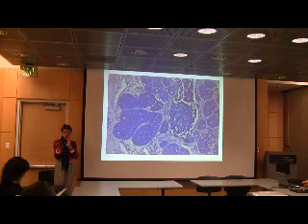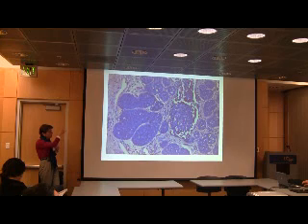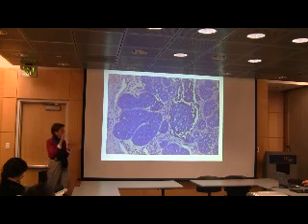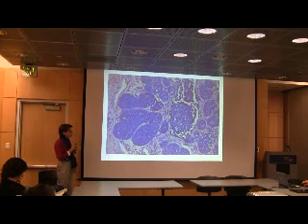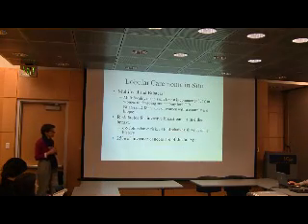And you can imagine that there is a gray zone there too. You look at it and you say, is it really expanded or is it not? And sometimes it's hard to tell. So we often look around, and lobular carcinoma in situ is usually not one spot. It's usually several lobules, or many lobules, that are involved in it. So we gauge from the whole process. Next.